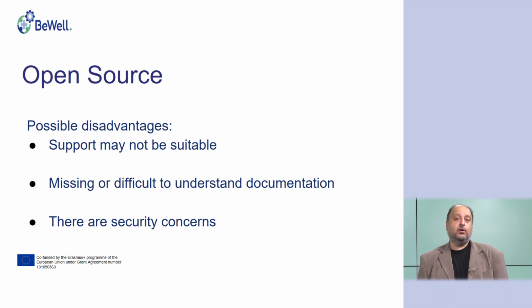With contracts, of course, the company that supplies the system is obliged to provide some support, to answer the questions and so on, but it is not the same as with the open systems. With an open system, you may ask a question and never receive a reply.